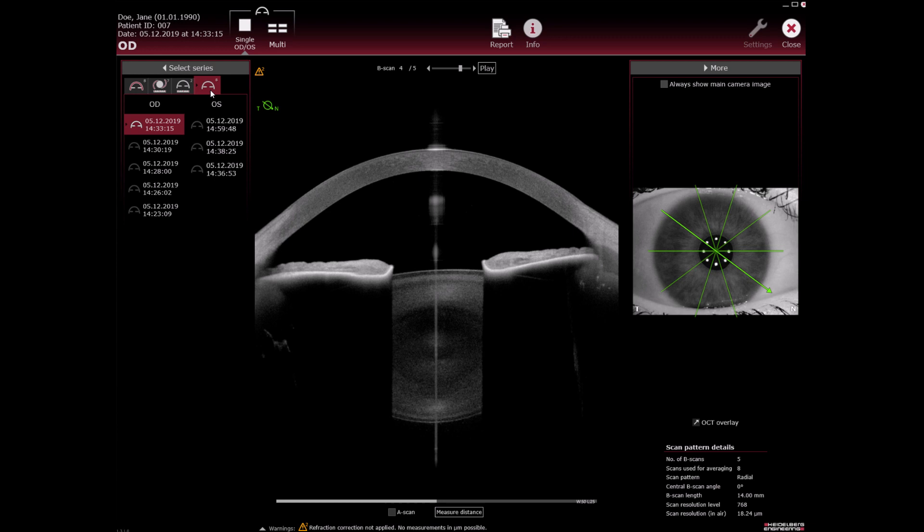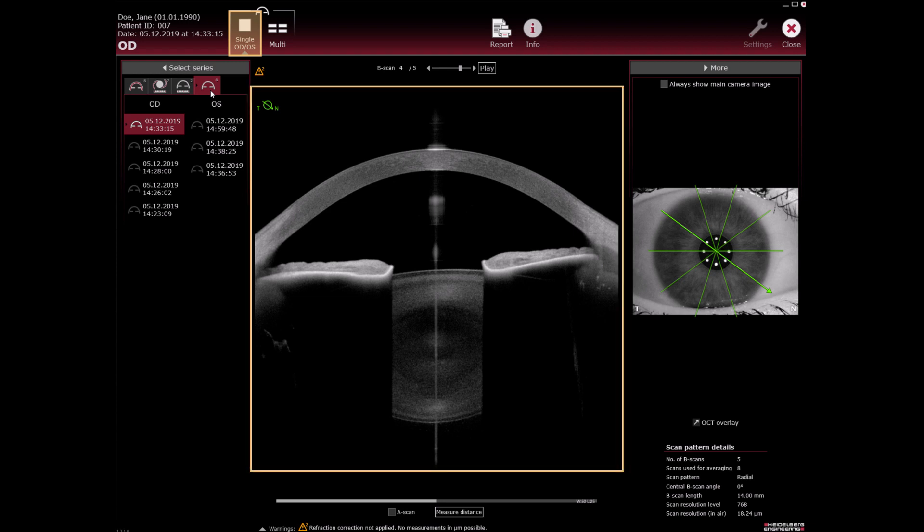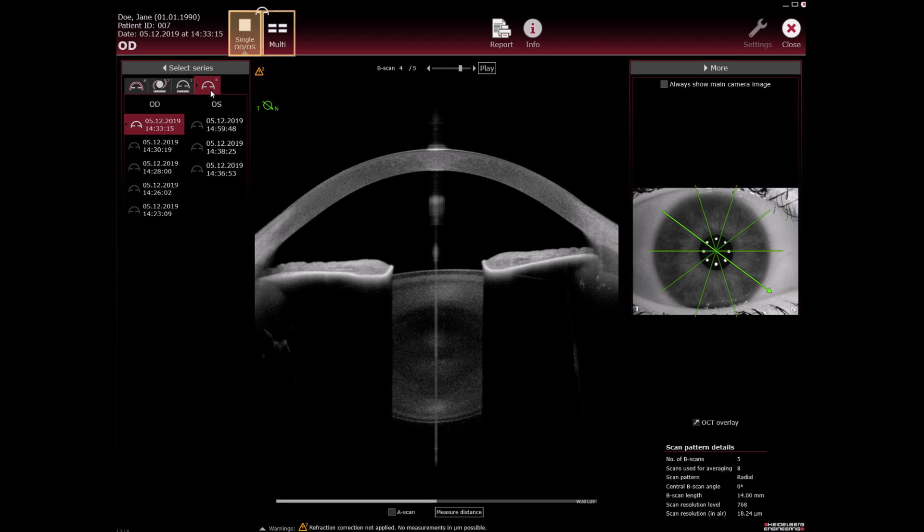Imaging application. Single view of the most current acquisition OD is shown. OCT section and camera image with scan pattern overlay, details regarding the scan pattern. Multi-view is available.